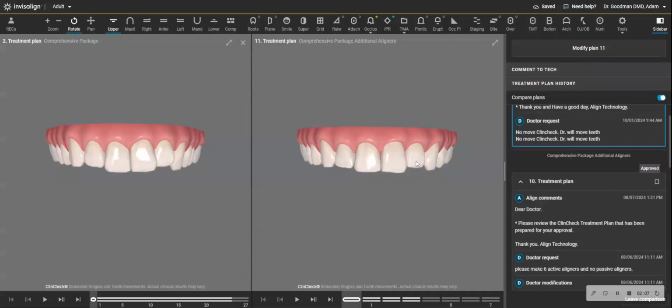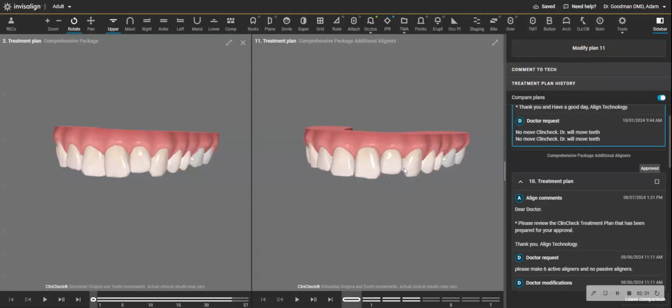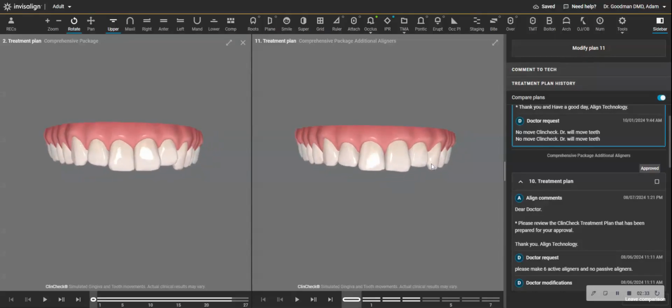If this tooth were to be brought down, which is hard to do, to compensate for the problem, which is a short crown, that would bring the gum line further down. And when the patient smiled, you'd see a little bit of a gummy smile in that area. The answer for this patient is to leave this individual characteristic as it is, which maybe will be de-emphasized by reshaping this tooth, or add length to this tooth with some sort of bonding or ceramic veneer.